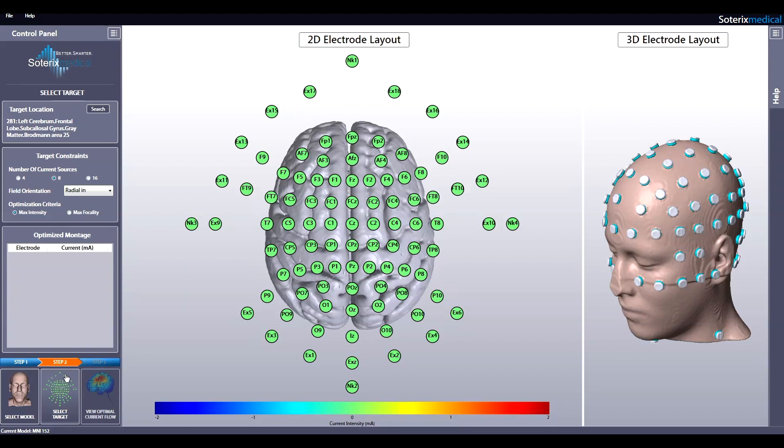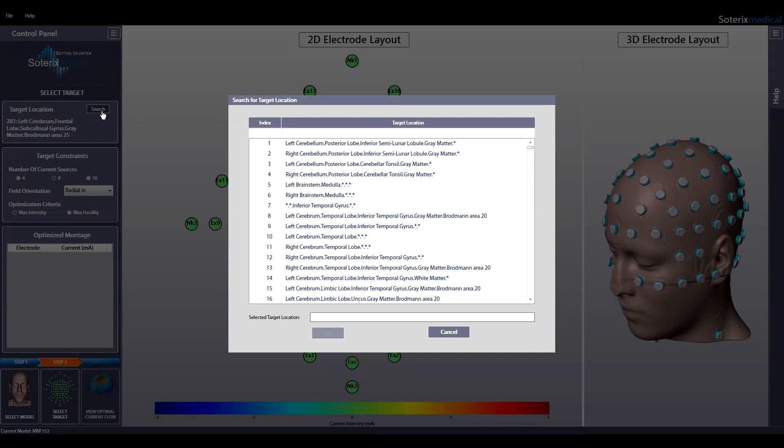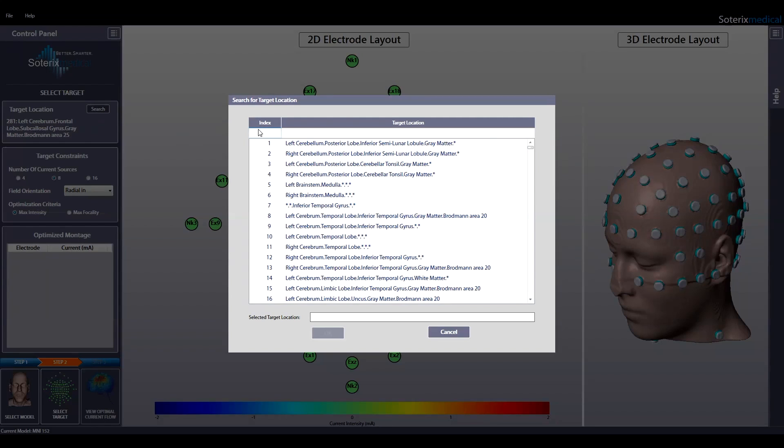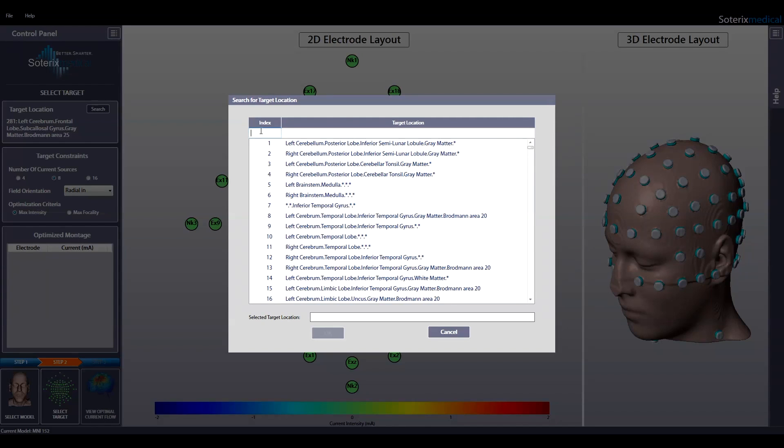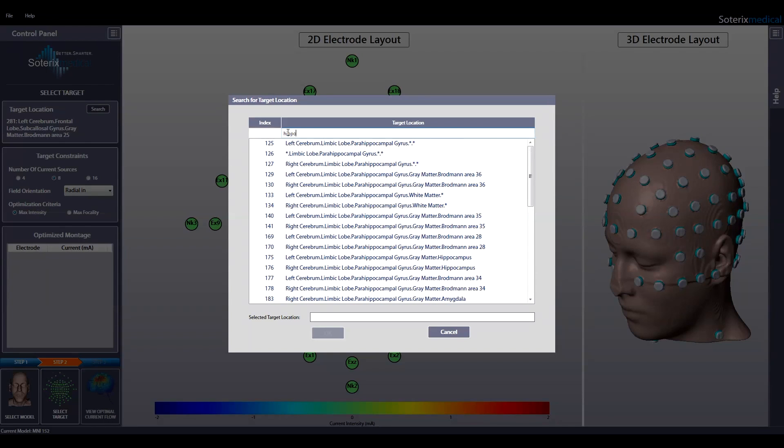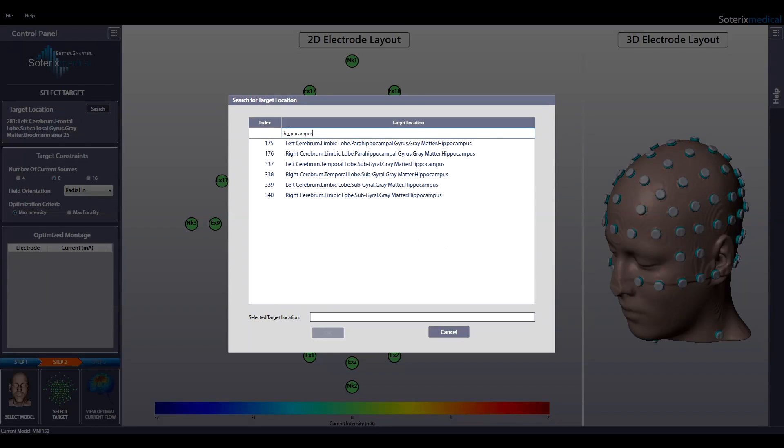Step 2: In the second step, you first select your desired target in the brain. Hit the search button to launch a new window to search for available targets. You have 1,105 target locations to choose from. You can either search by index number on the top left or by entering a keyword on the top right. For instance, entering keyword hippocampus results in 6 hits.